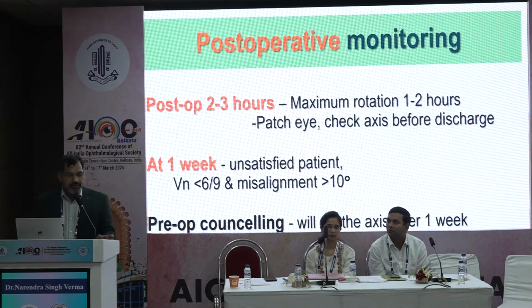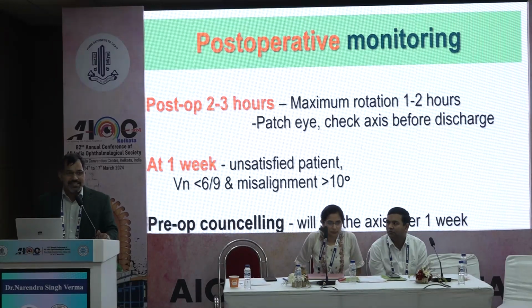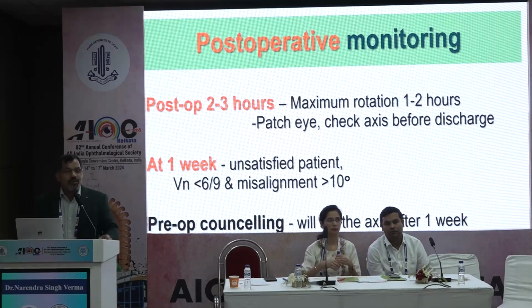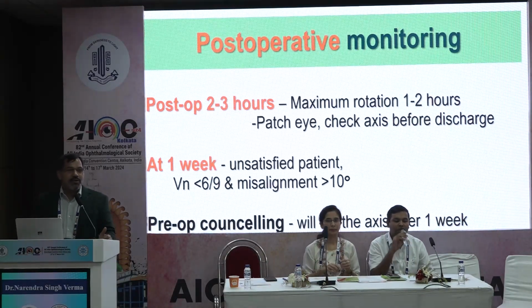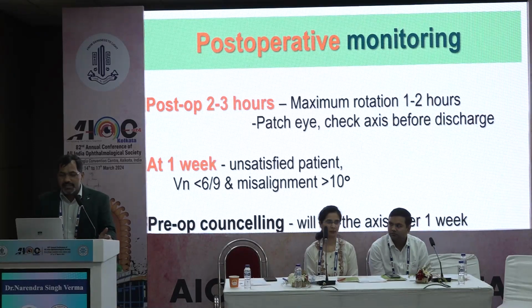One thing I will try to tell you is that you can add one sentence in preoperative counseling: presently you are putting the lens, you are targeting the power, you are correcting the power, not correcting the axis. After 7 days I will take you to the operation table and then I will adjust the axis. So if by chance there is a need for realignment, the patient will not think that you are doing surgery again because there is some complication. That sentence you can add in the pre-counseling.